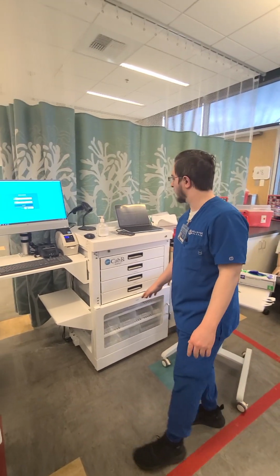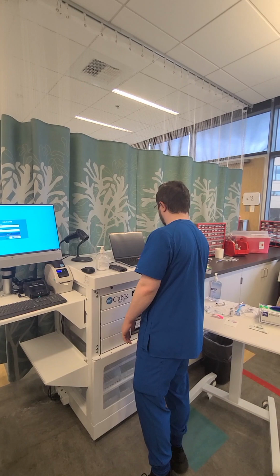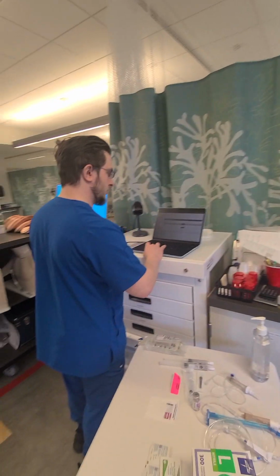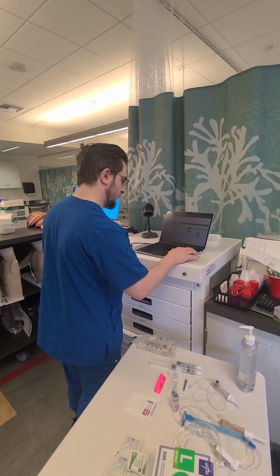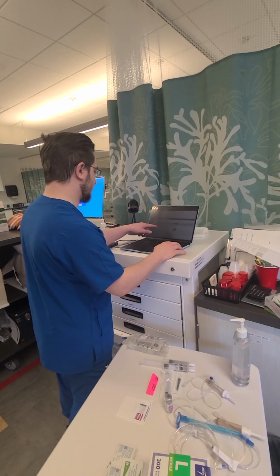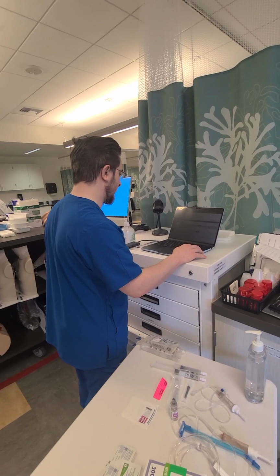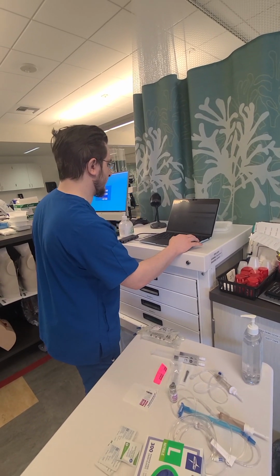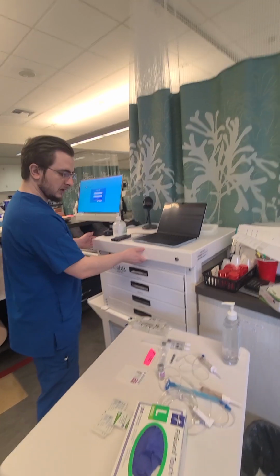All right, so we're here in the medication room, just checking on my orders for my patient. Patient is Erica Track. I've got 2 medications for her right now: ciprofloxacin, an antibiotic, 400 milligrams in 200 milliliters of D5W, and then ondansetron, 4 milligrams, PRN, IV push. So I'm going to drop both of those from the Pyxis.